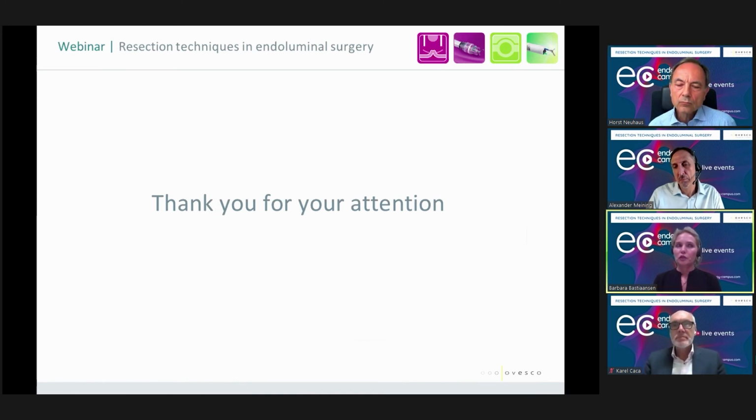Well, for the stool softeners, of course, I don't have any evidence. It's just a personal feel that with a wedge, what we do in full thickness resection is we perform a wedge resection in the left-sided colon. So per definition, there will be a relative stenosis at the level of the clip. And well, of course, since pressures and stools are higher in the left-sided colon, then I believe these high pressures can indeed contribute to tissue rupture at the level of the clip.